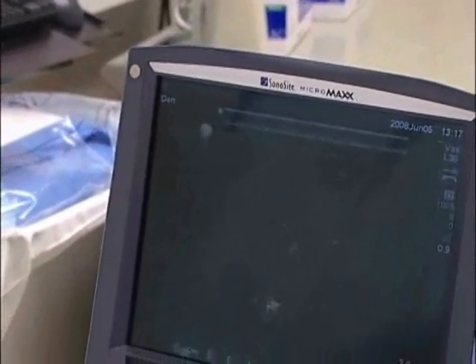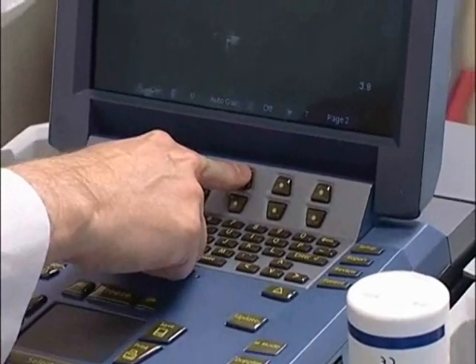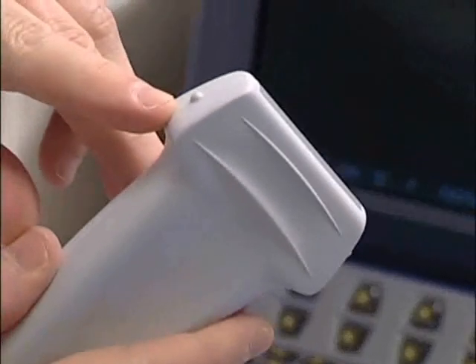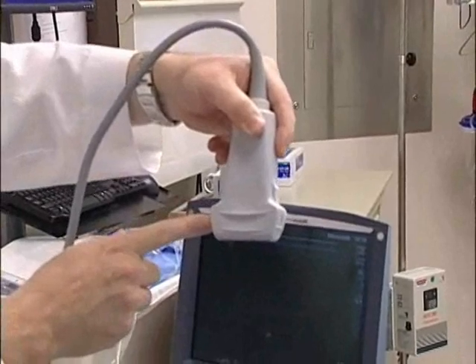Make sure the machine is in the general mode. The mode is set down here. It should not be in MB or any other mode. The green dot indicates the index position on the probe. This is helpful for orienting yourself in terms of the machine. The green dot indicates that this is this side of the probe.